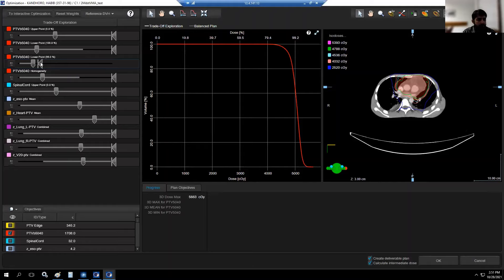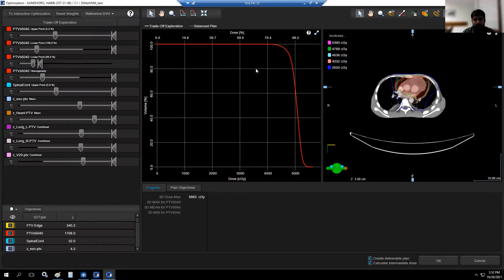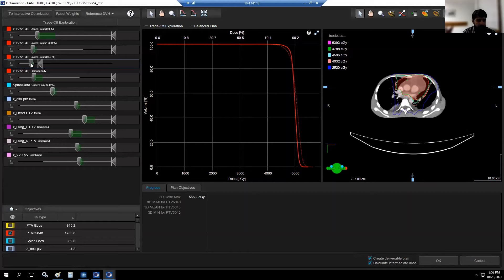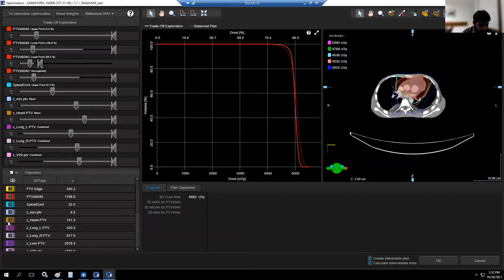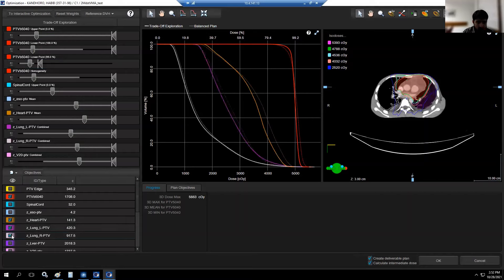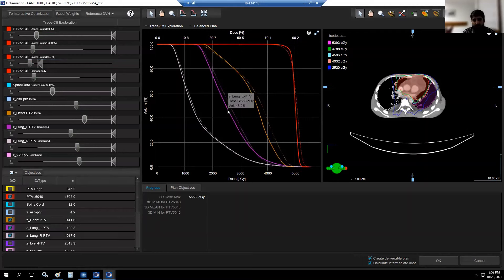As I move toward the left, you can see some OAR capabilities are reduced — we can't move further from here. If I try to improve the PTV further, you will see the difference shown as dotted lines, and you can see the green lines — everything is moving to the left. Moving the PTV affects all other OARs as well. I'll open the other objectives: heart, left lung, and right lung. Here you can see the dotted line representing the original plan, the balance plan, and what happens when I move the PTV.